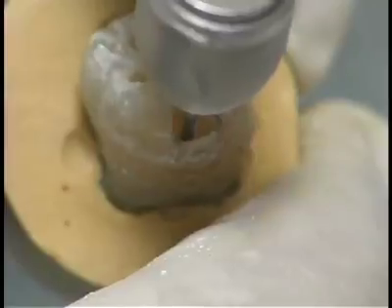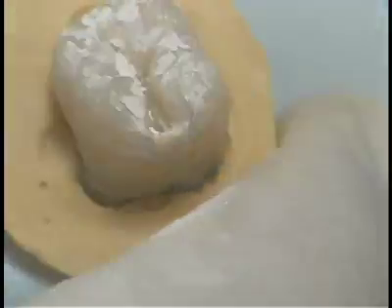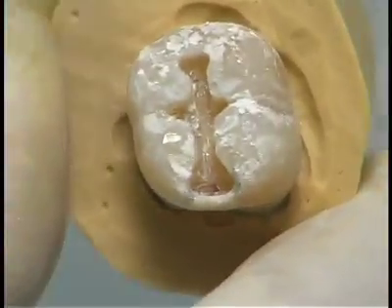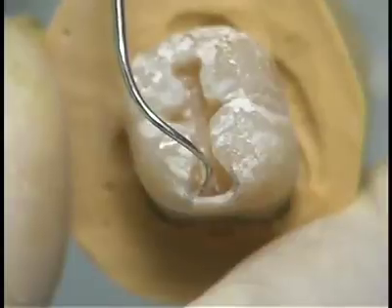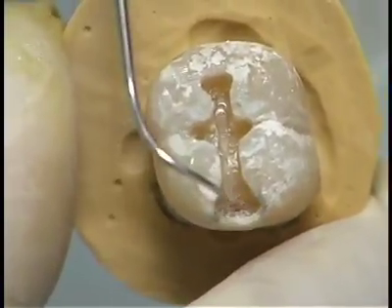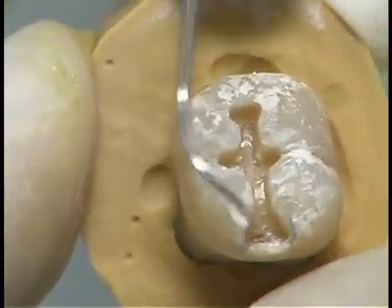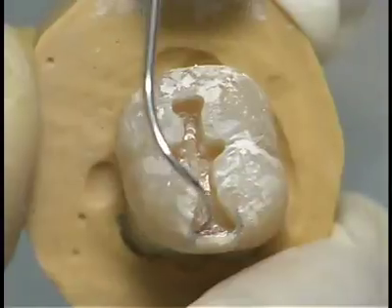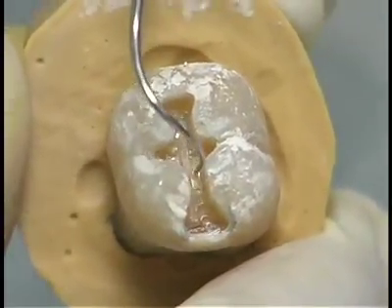6. All margins are smoothed and curved. 7. The marginal ridge is thinned out as much as possible and gives a clear view in order to access the proximal box. 8. The dentino-enamel junction is visible and clear. 9. Resistance principles are followed when walls are curved and extend around the cusps. 10. The margins are placed on smooth and sound tooth structure.